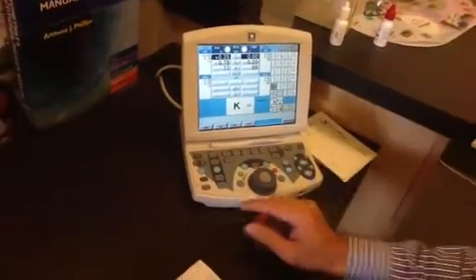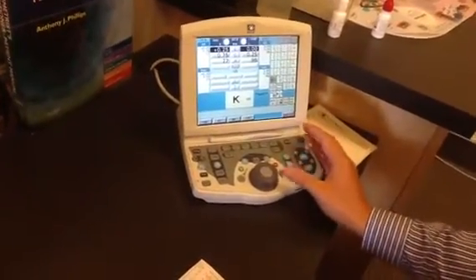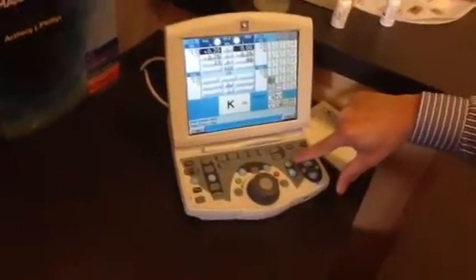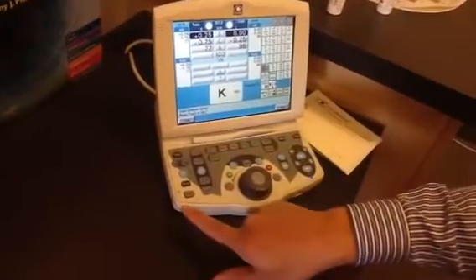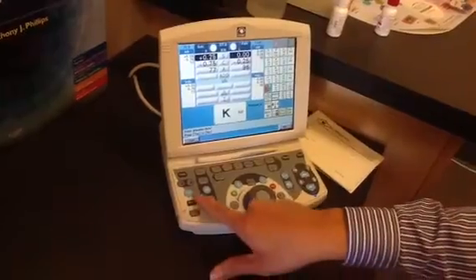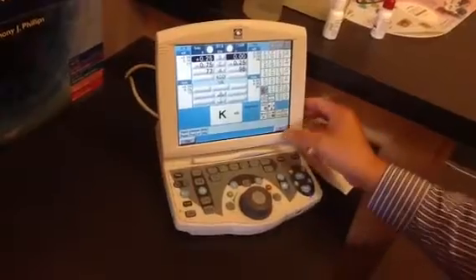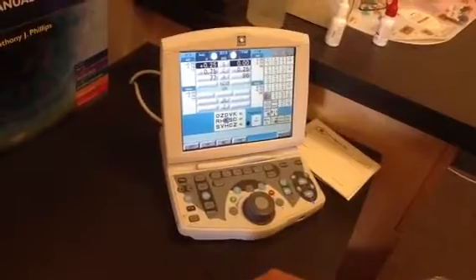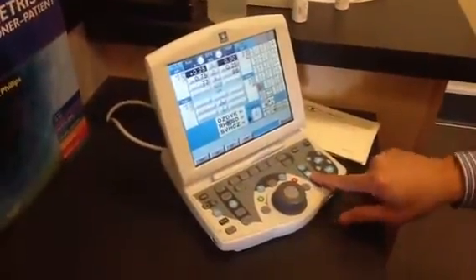We'll get started with the exam. This machine has a program. All you have to do is press the program button right here. It's going to ask you if you want to input glasses data — that's when you can input the lensometry reading by pressing those two buttons. Press NO for now and you can go forward. I usually just go forward by pressing this button right here, and it takes you to the next steps.